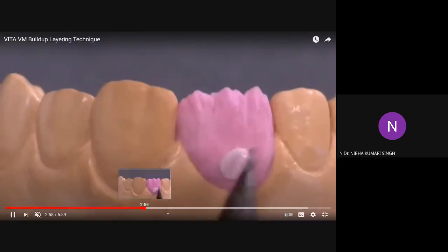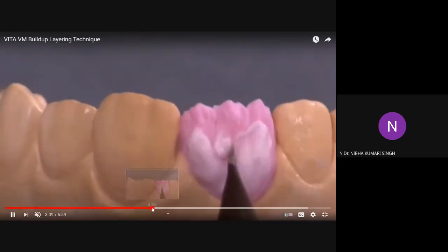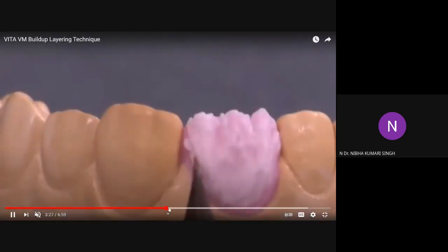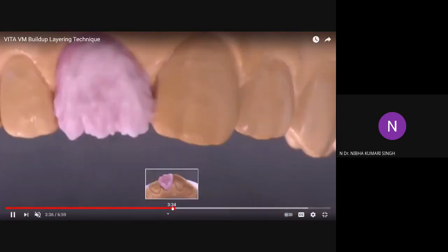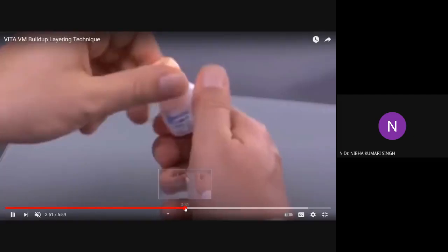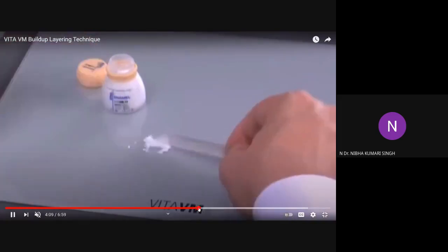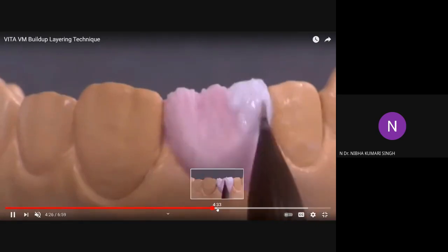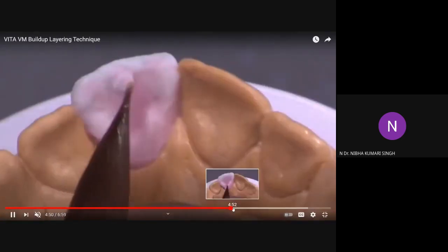The enamel porcelain will be a little transparent and of whiter color. Compared to the adjacent teeth it is overcontoured, because it will lose water and shrink. That's why it is bulky or overcontoured. So the second layer is also built up, and now they will do the firing. And finally the incisal porcelain, applied only on the incisal surfaces to give a transparent appearance.